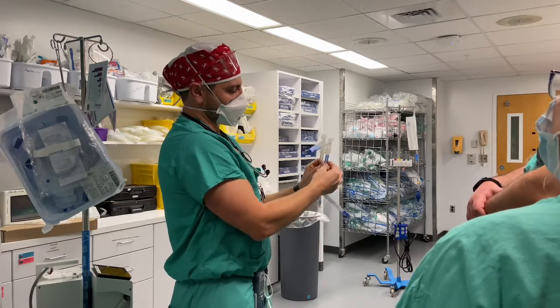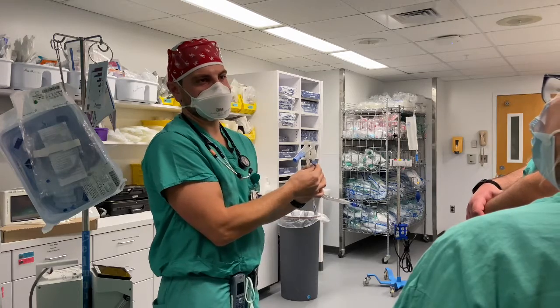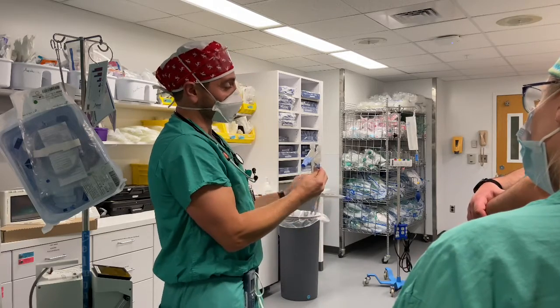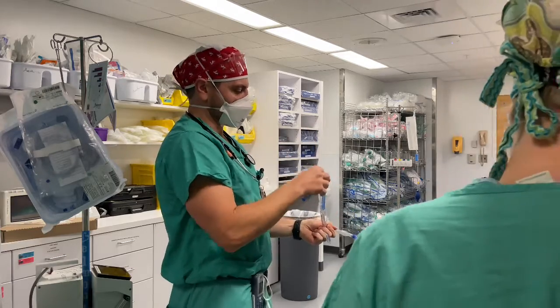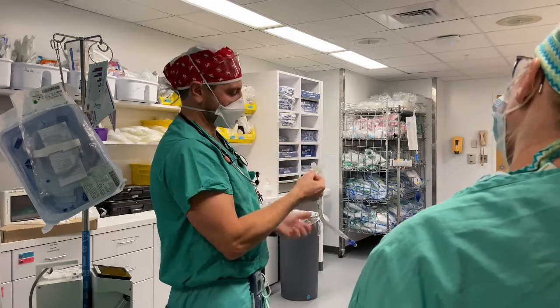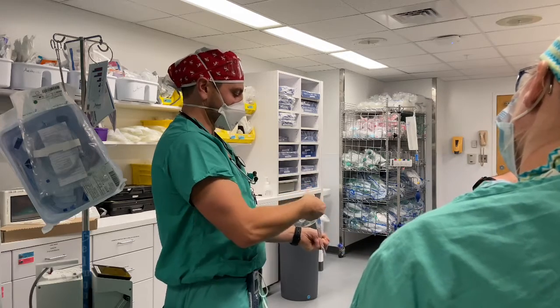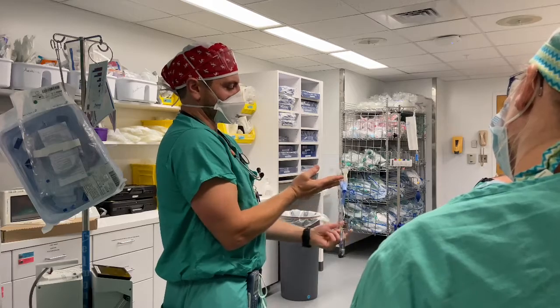A lot of people you'll see putting their clamp down here, and those are people who don't always understand what they're doing or are confused as to which side they're working on. But if you clamp down here, that lung's going to stay inflated because that air that's in it already has no way of escaping. Okay, so you pop this open to let air out, clamp this here so that you stop blowing air in. All right, if I wanted to isolate the left side and stop ventilating it, I would just close this, take the clamp off, move it to this side, and let this side deflate.